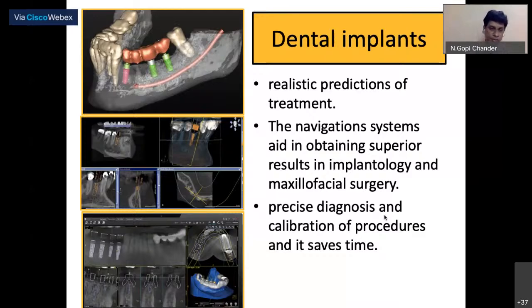You take different sizes of implant, place them there, check both buccal and lingual positions, or mesial and distal positions, check the viability of the bone, whether it's going to interfere with adjacent teeth or certain anatomical landmarks, locate and position it in terms of angulations, and design your restorations. It's made it very simple. Everything is going to be done in the systems.